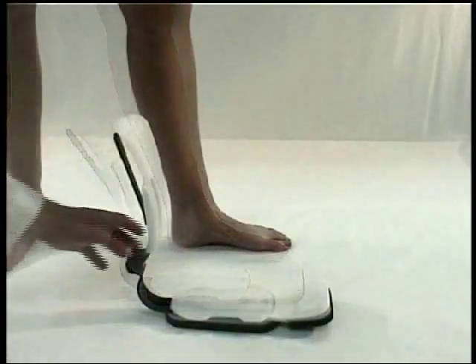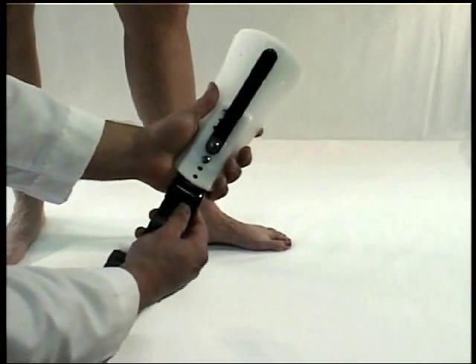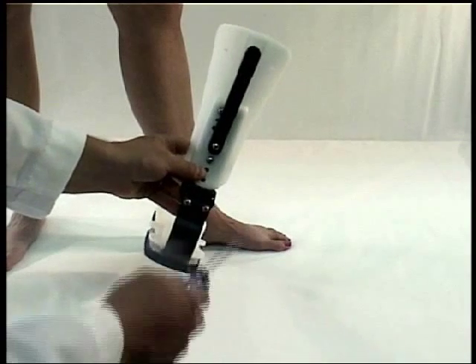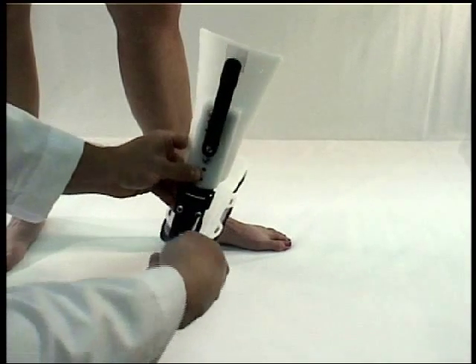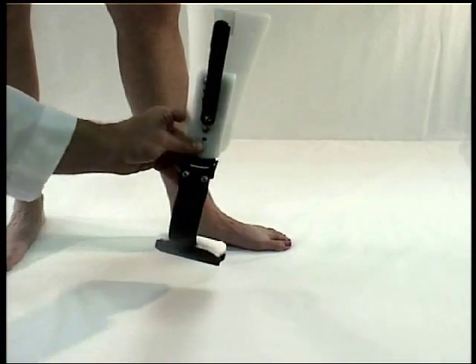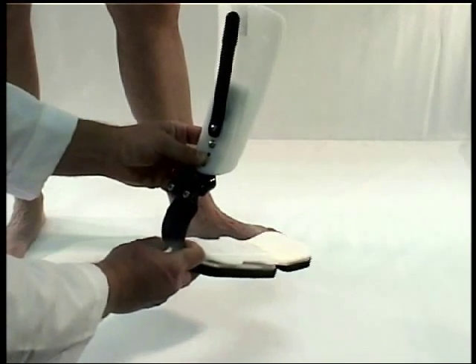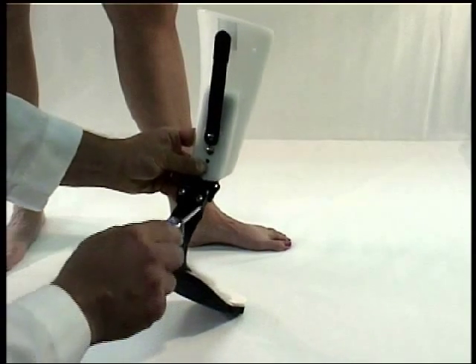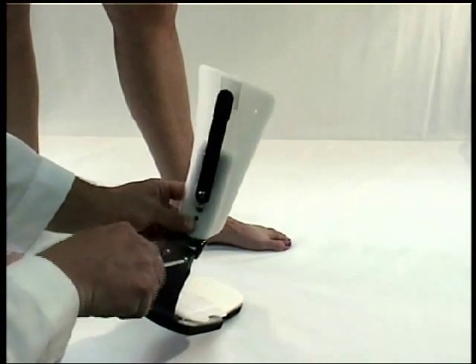To adjust the posterior single upright, slide the protective cover away from the joint to expose the two screws. Loosen both screws and set the foot-ankle segment based on the measurement recorded earlier to accommodate the patient's end range. Retighten the screws securely after the adjustment is made.